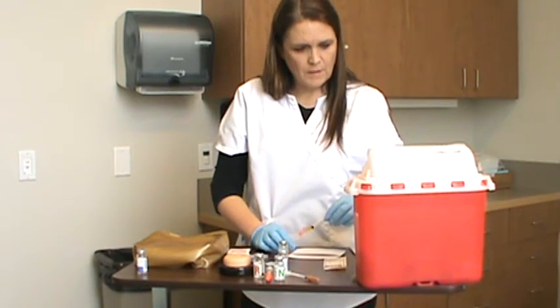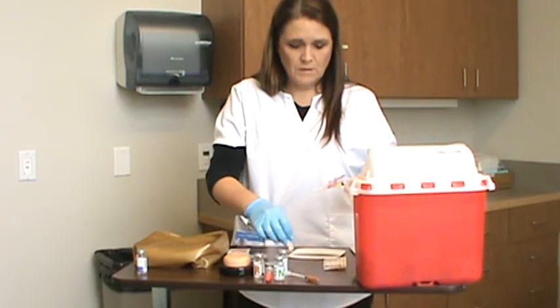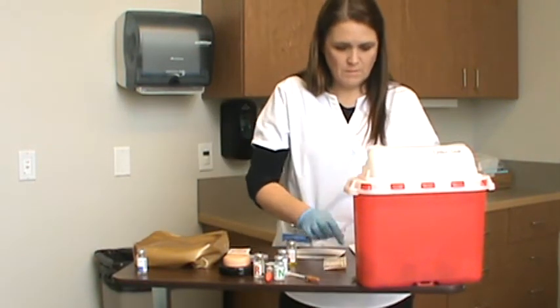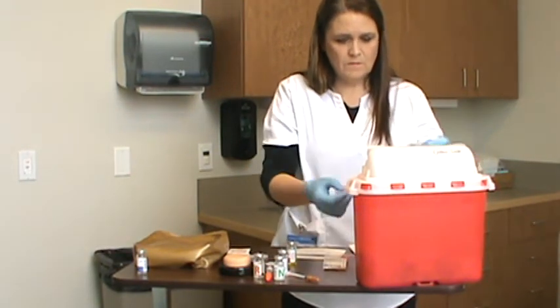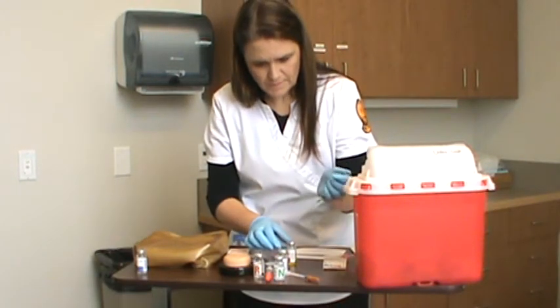And I think I'm going to waste this because I should have drawn this up with a filter needle, because this had particles in it, so I'm going to waste that. Draw it up with a filter needle.